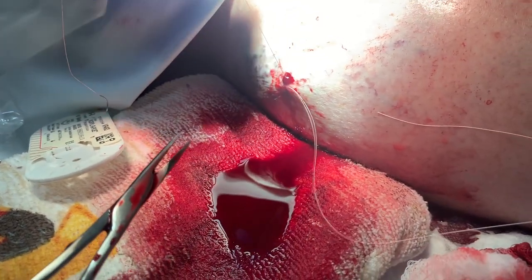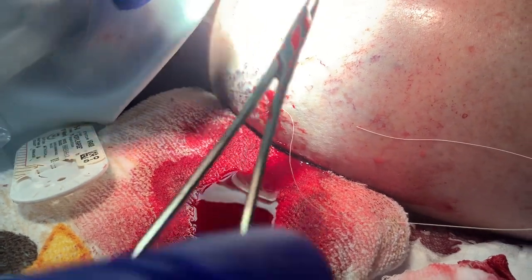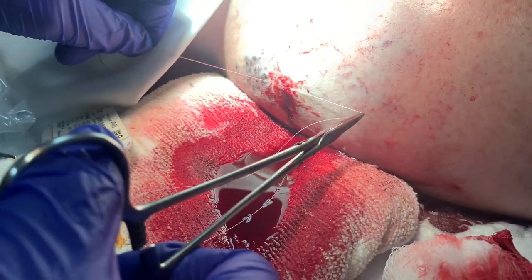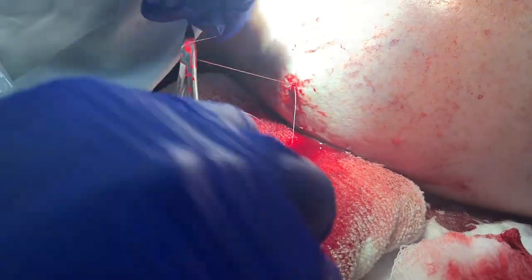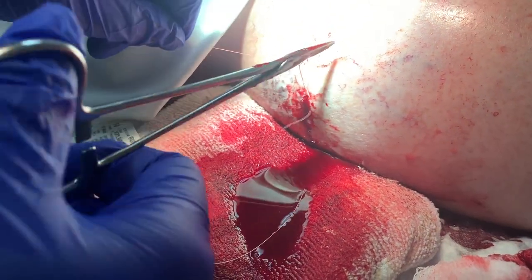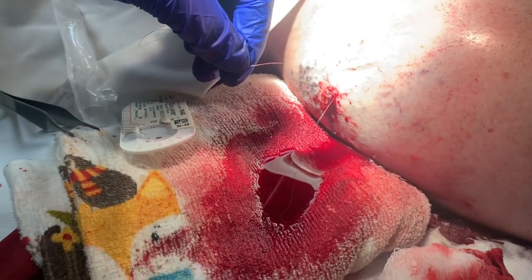Tension. Okay. A lot of pulling. I'm going to tie it off. I don't care about the long tail because all I wanted was to stop this. And then I'm going to use the same thread to do one more stitch.